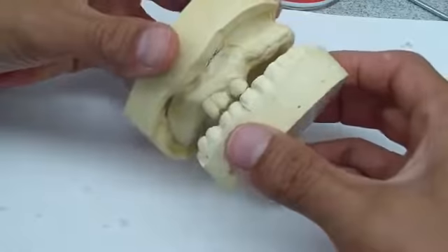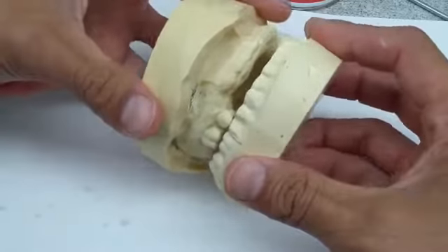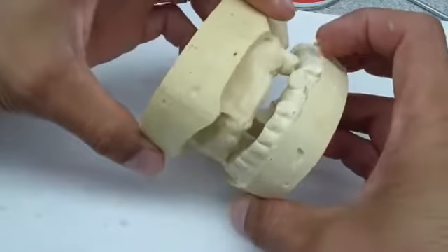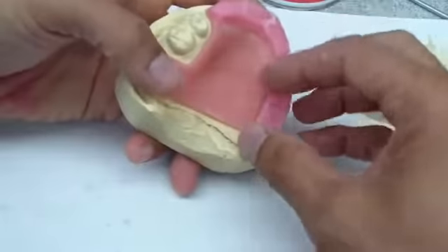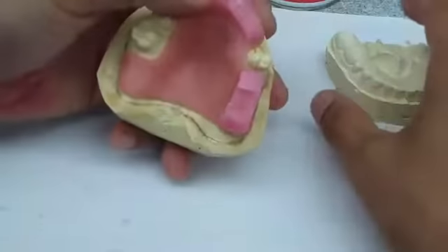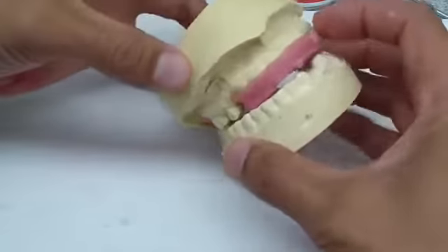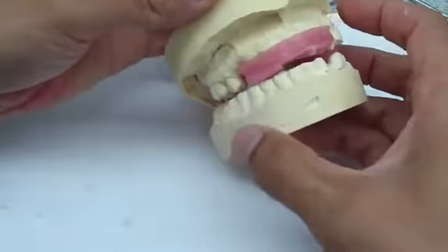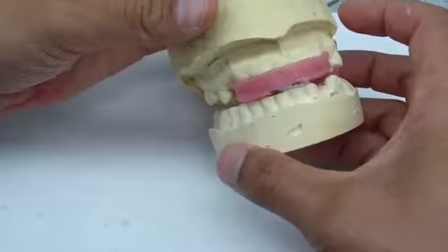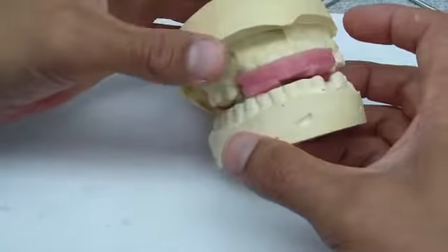So you can see right now, I tried doing that actually with Blue Mousse and another material, and it just isn't stable enough. So I'm going to show you one way to fabricate these simple denture base jaw relation records, and then we'll have something stable that I can place on the cast, mount the cast together in proper orientation in 3D, and then continue with fabricating the immediate complete maxillary denture.